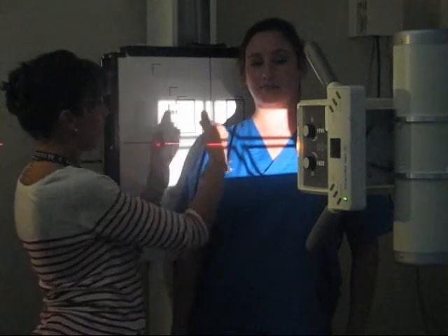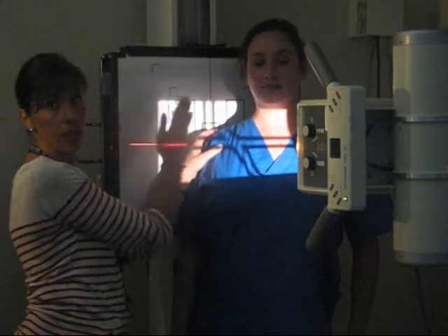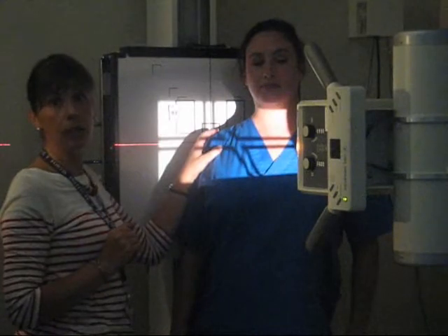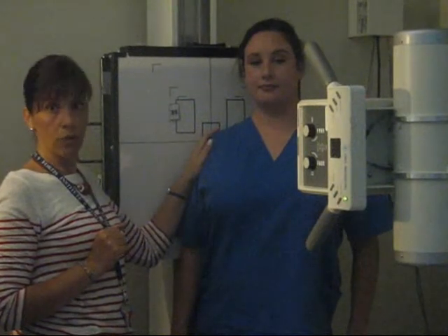And in this way, because the joint is angled in this way, you basically opened up the space so that the doctor can see right through it, okay? And you'll be able to determine the integrity of the joint. So this will be your AP axial of the shoulder.